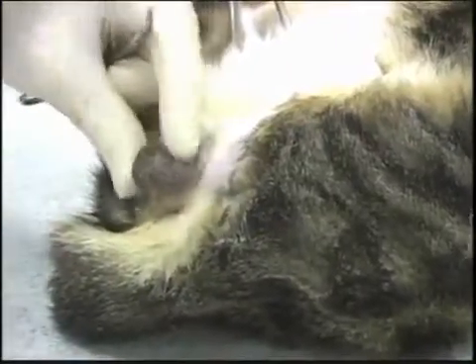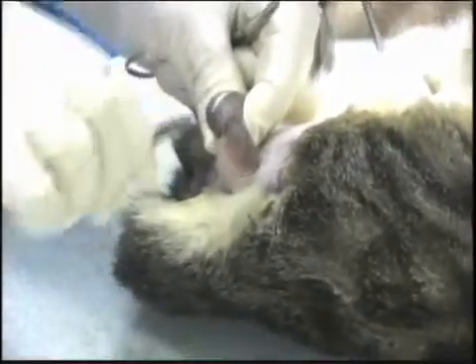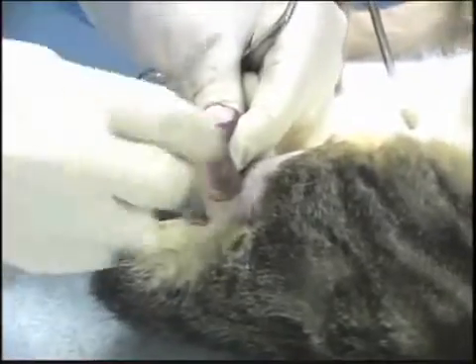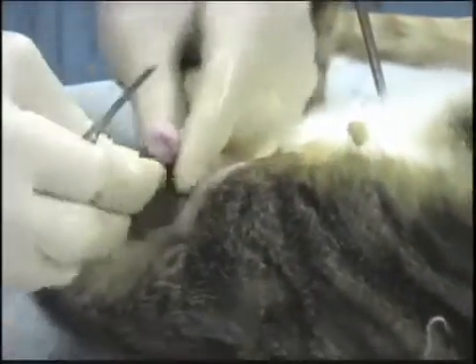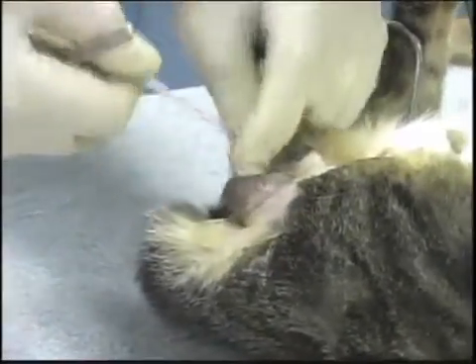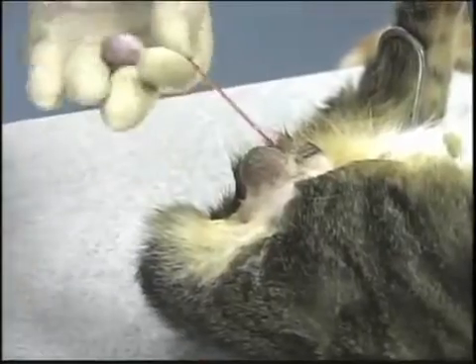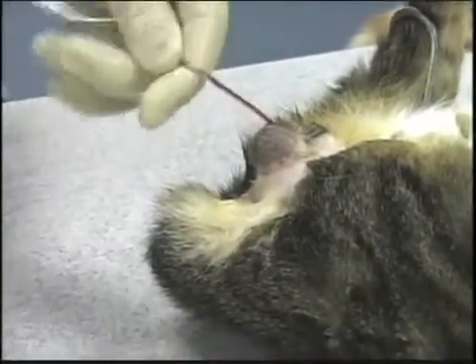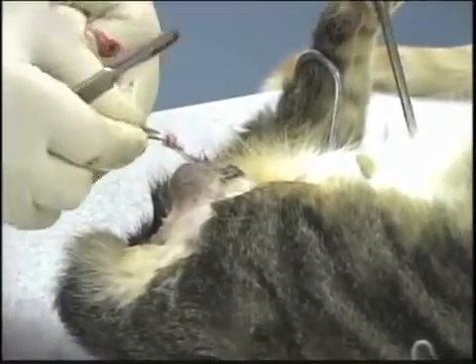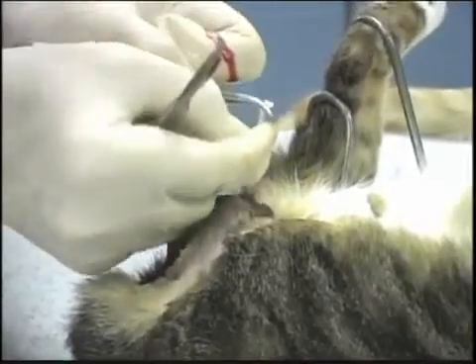Here we have a very large male. There are two ways of doing the large male. When they're more mature like this, they really have tightened tissues around there. They're sometimes difficult to separate and bring out, and be able to do a closed castration. I will do a closed castration on this one — pressing a little, create an overhand knot, then taking a hold of it and pulling it and cinching it down.